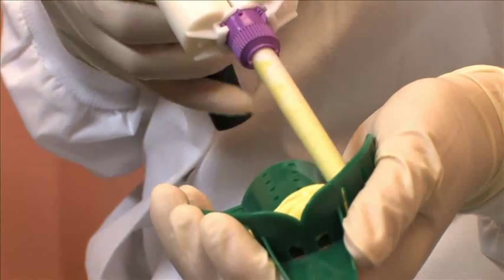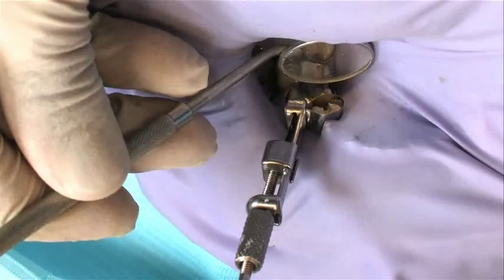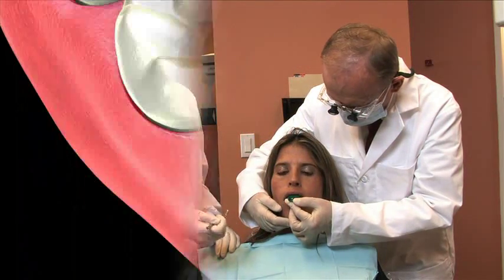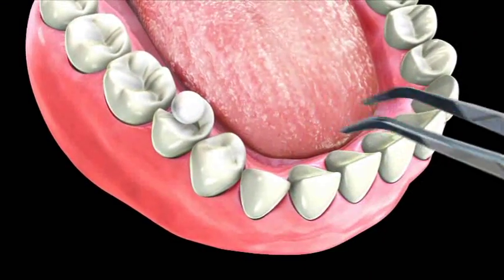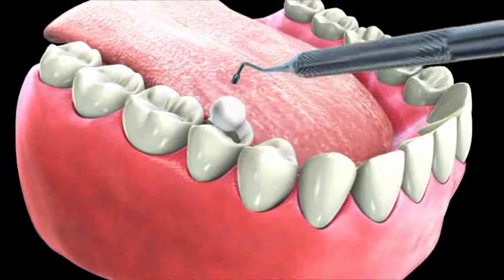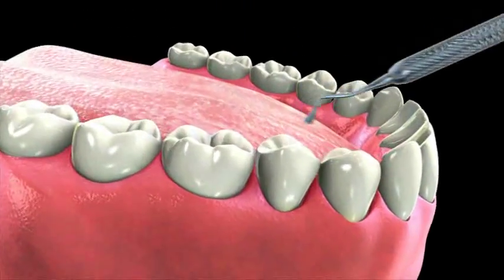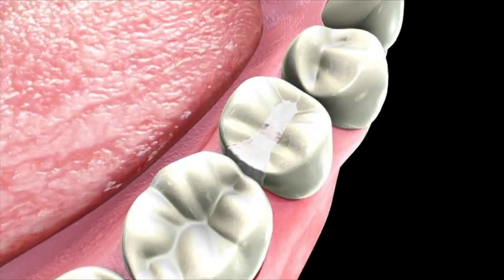Inlays are custom fit fillings made in a laboratory. First, the decay is cleaned from your tooth and then an impression of the tooth is made and sent to the lab. In the interim, a temporary filling is used to fill in the space and protect your tooth from fracture or further deterioration. It's important that you avoid chewing or applying any stress to the temporary filling as it may be fragile.